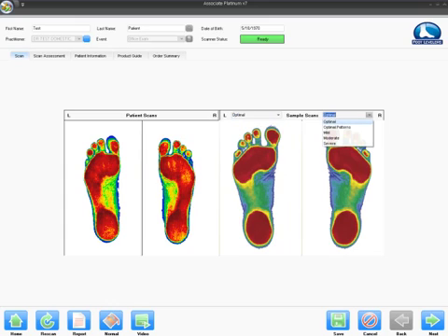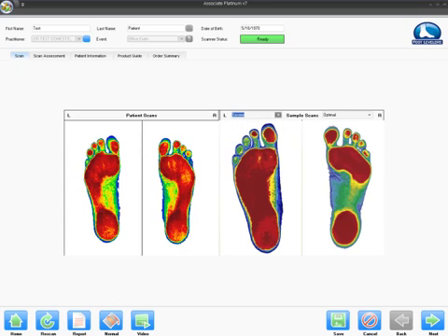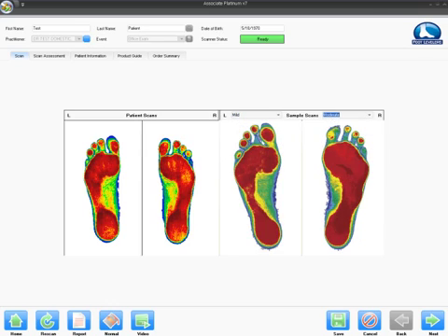Next, involve the patient by asking them a few questions such as, does your right foot look like your left foot? Does your foot scan look like the optimal scan or the mild, moderate, or severe foot? Finally, educate the patient on spinal pelvic stabilizers by teaching them that they provide the support for a balanced symmetrical foundation, enhance the effectiveness of chiropractic treatment, and ultimately improve the patient's quality of life by relieving postural stress.